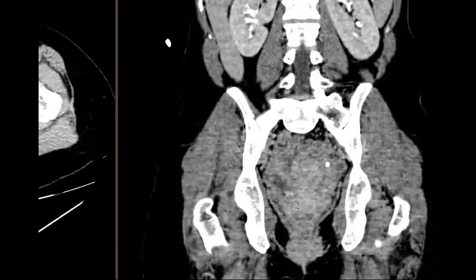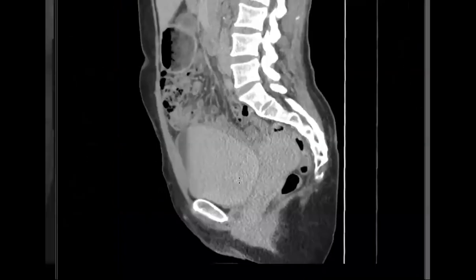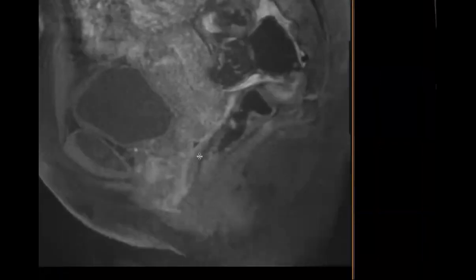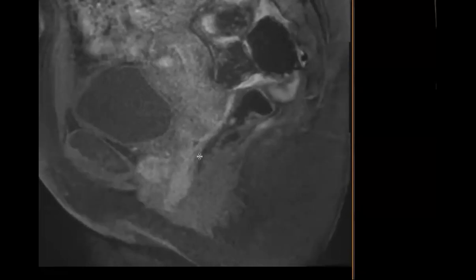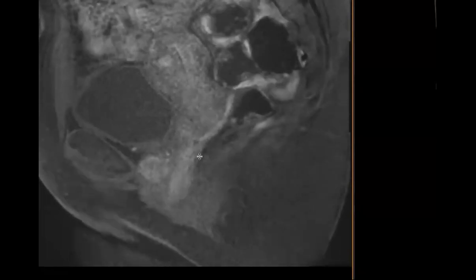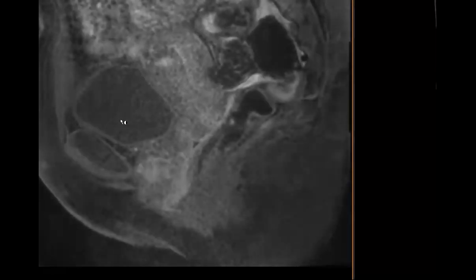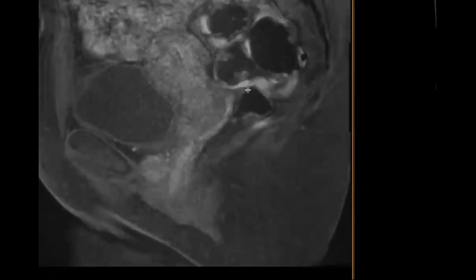Do you know what the path is? Because usually in diverticula, you get adenocarcinoma, whereas if it's de novo from the urethra, it's either squamous or urothelial. Yeah, they called it transitional cell. But the other thing they also said was the bulk of the mass was beneath the mucosa. They could see only a small portion of mucosal abnormality, but the bulk of the tumor, they said, was beneath the mucosa. And despite that, which you might think might be from a diverticulum and adenocarcinoma, they called it transitional cell carcinoma. So just interesting.